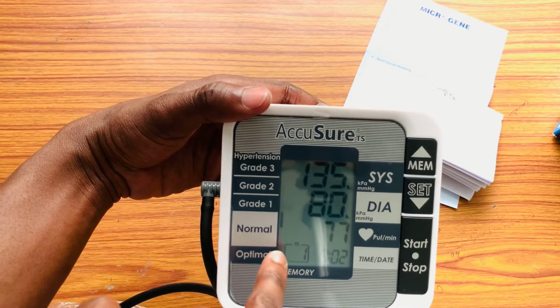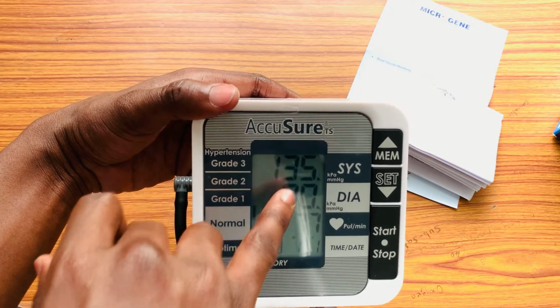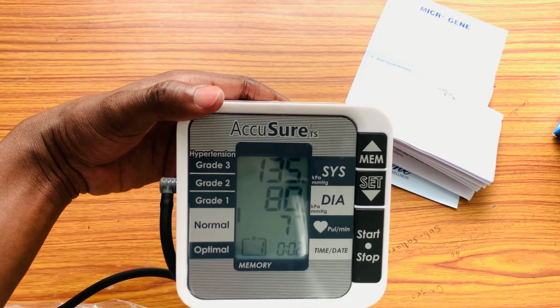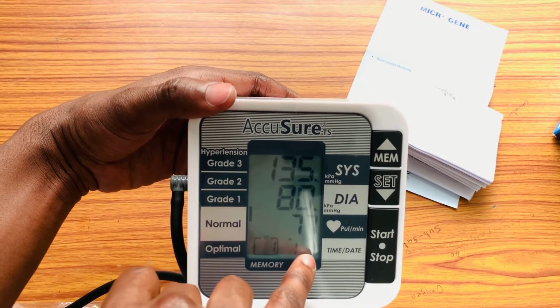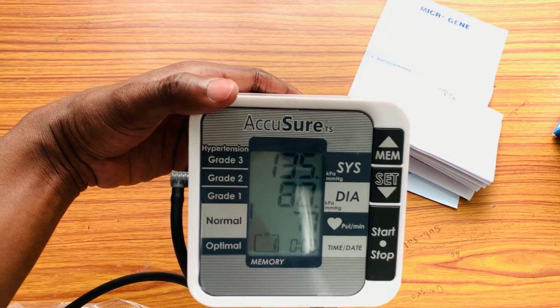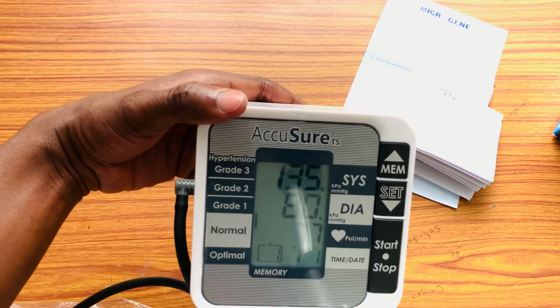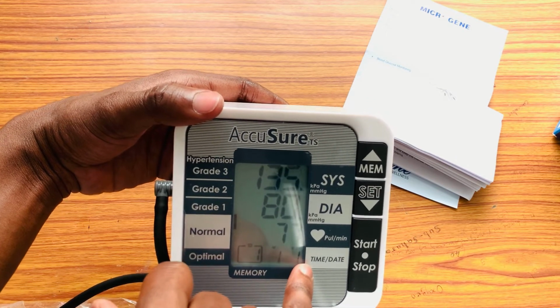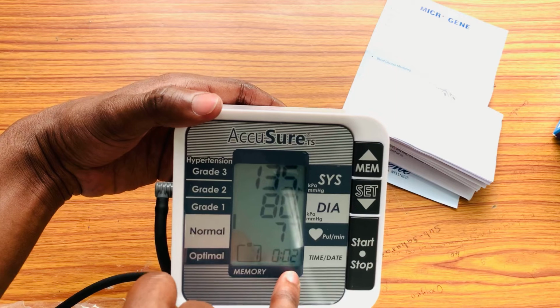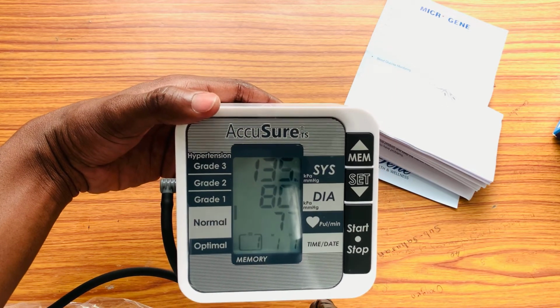That was me. Just recently I was the one that used this device. You can see my BP, you can see my pulse, and the exact time this was taken. The date and time of this device is not set right now, so that's why it is showing first month, which is January 1st, and then it is showing it was 2 o'clock. Sorry, it was 12 o'clock, so that's why.